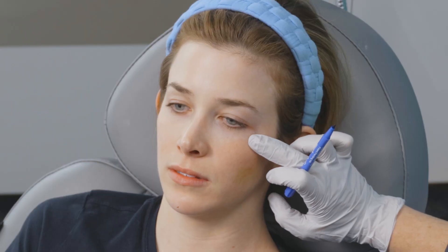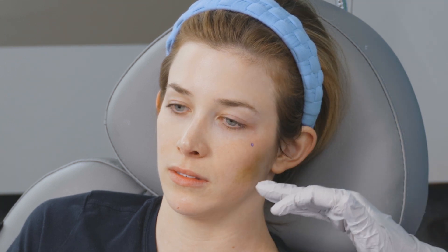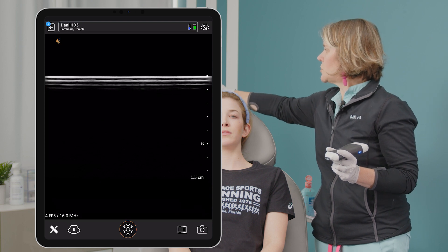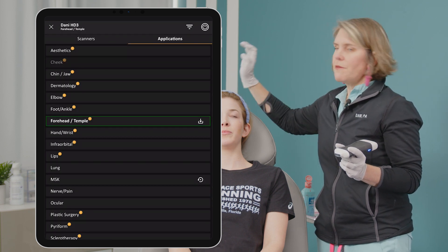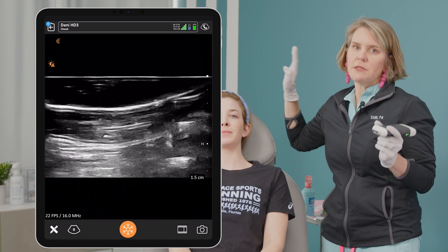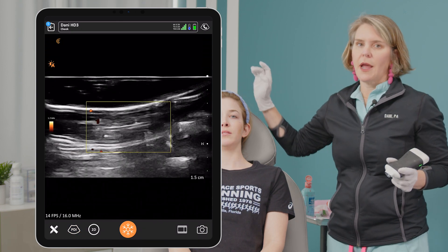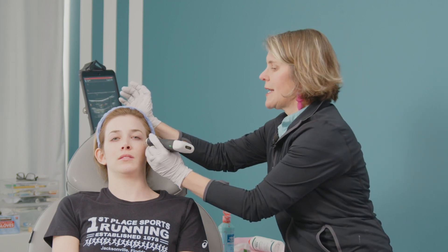Grace has a little bit of volume loss right here. So what I do is take a surgical marker and put a little dot. This is a gentian violet marker which doesn't wash off easily with ultrasound gel — that's important because we want to be able to ultrasound over it. To safe map that spot, the first thing we want to do is go to our new Clarius settings. We have a cheek setting which should be a really nice beginning setting for the cheek.